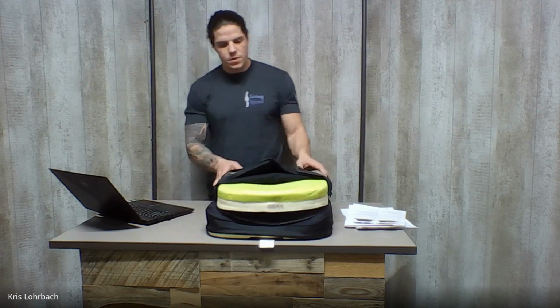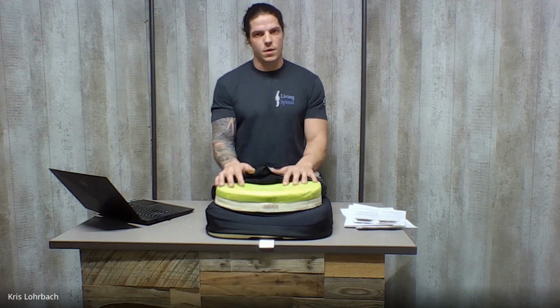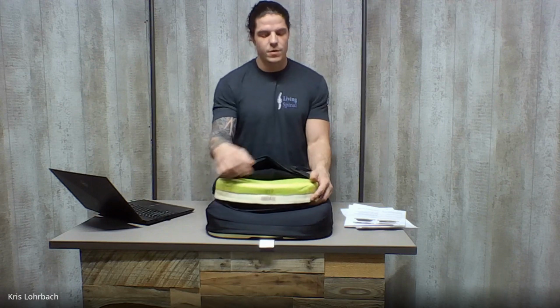Let's jump to foam, because we've been talking about it a lot. So foam cushions, there's a huge variety of foam cushions. It's probably the largest category because it's cheap. It's cheap to manufacture, cheap to sell. A lot of people sit on them, and they usually layer them. So you have different layers of foam that have different densities.